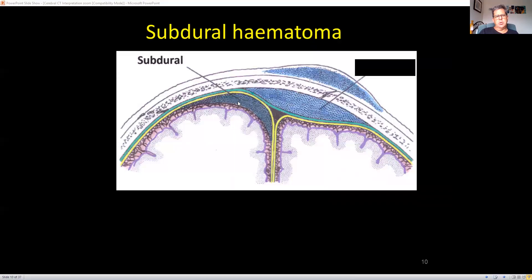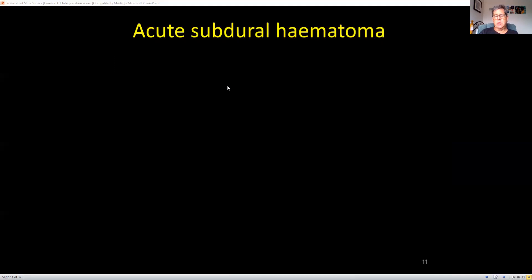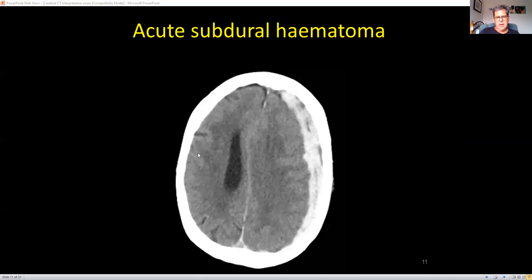In the subdural space, the hematoma is not limited by the cranial sutures like the extradural is. As a result, it becomes crescent-shaped and can be very prolonged and very long. With an acute subdural hematoma, it has blood so you'd expect it to be white — and there you can see it, a couple of centimetres wide all the way along. There's obliteration of the lateral ventricle, about two centimetres of midline shift, and the sulci on this side are pushed out by the subdural hematoma.